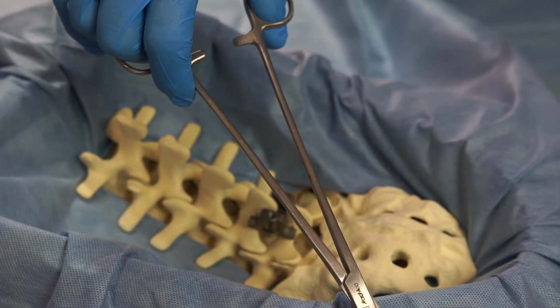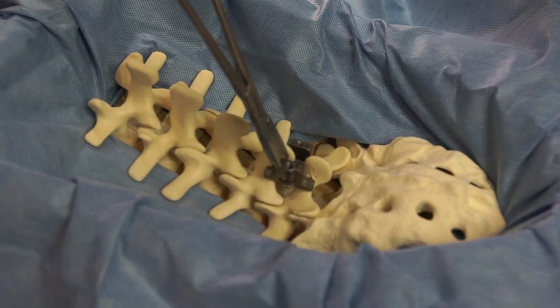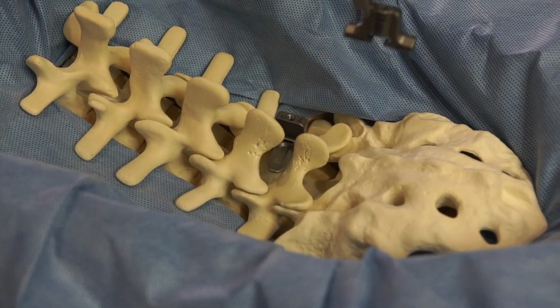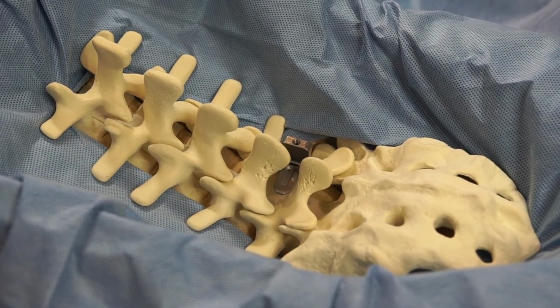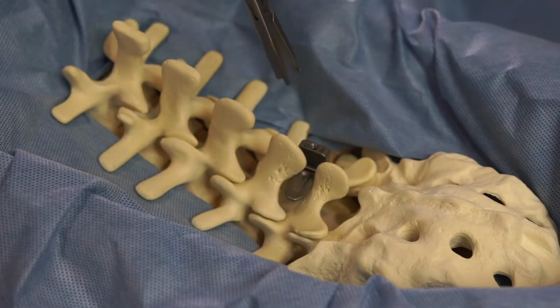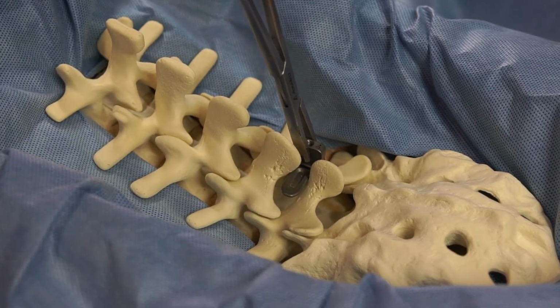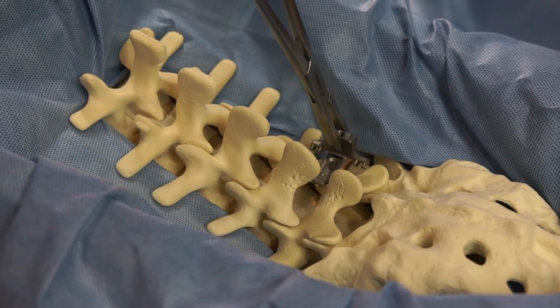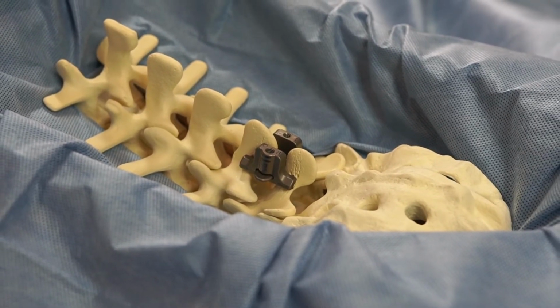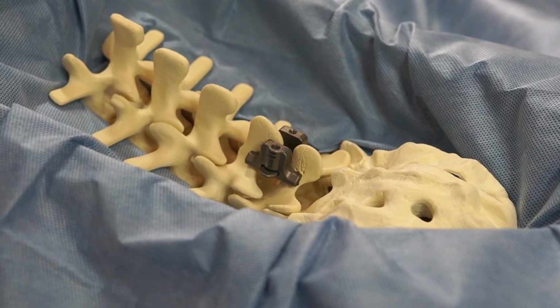Carefully separate the lock side from the tray side with a Cobb elevator or similar instrument and remove the implant from the surgical site. If the ligament was removed and bone graft material packed into the space, take special care not to disrupt the fusion mass if it is desirable to keep it intact. The Stabilink device can be used with bone graft material.